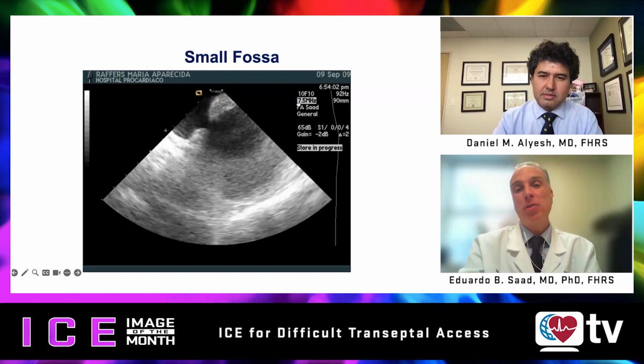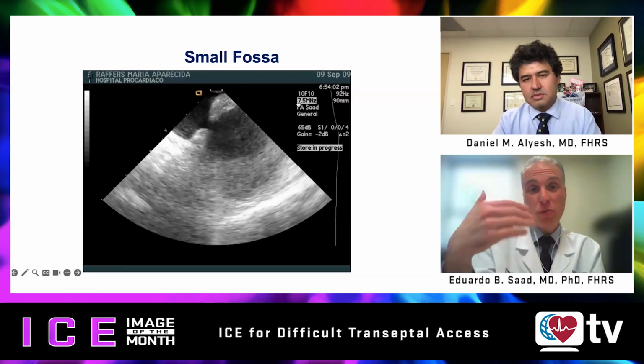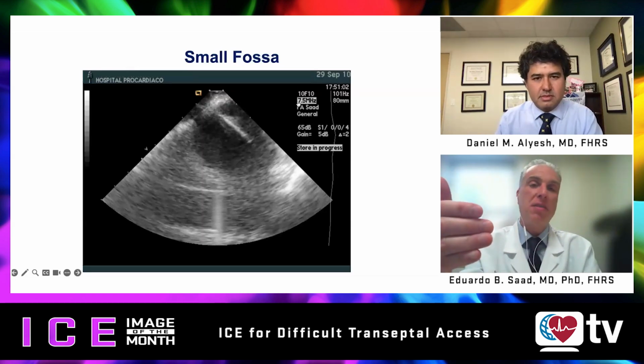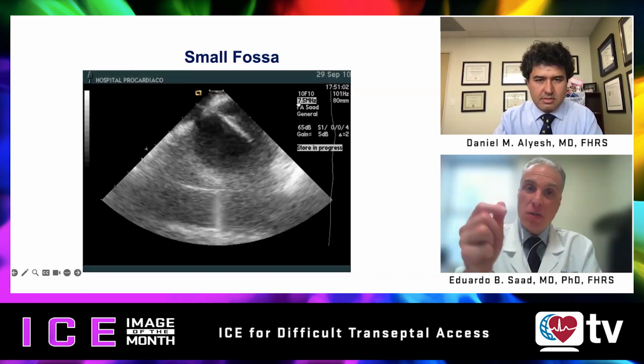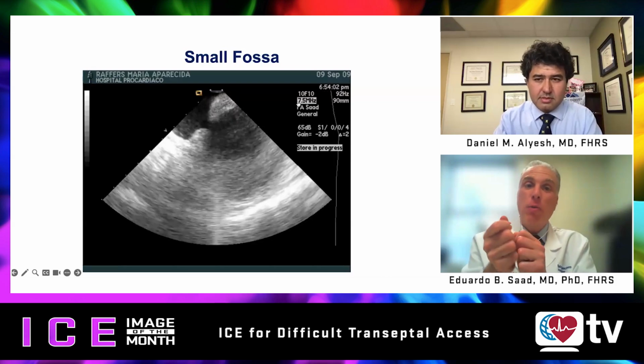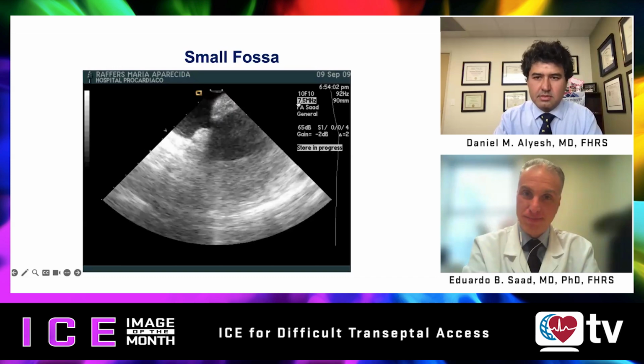So this example shows us that if the most that you have to troubleshoot in that situation is that you will need to not only engage that small fossa, but try to work your way without pushing too much so the system doesn't slide up to the thick portion.